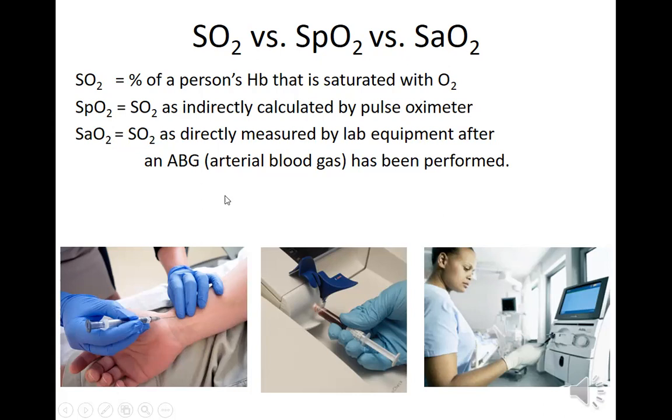If you want to find out the absolute amount of oxygen in this blood, and that's per deciliter of blood, whatever you're taking out, the machine is going to measure that. There's also a co-oximeter involved that can tell you the different gases that are binding at the same wavelength on the pulse oximeter versus the arterial blood gas.